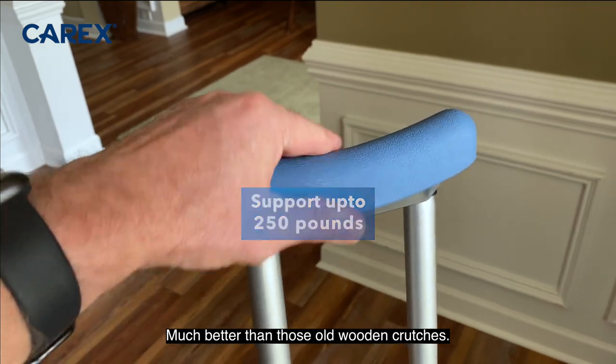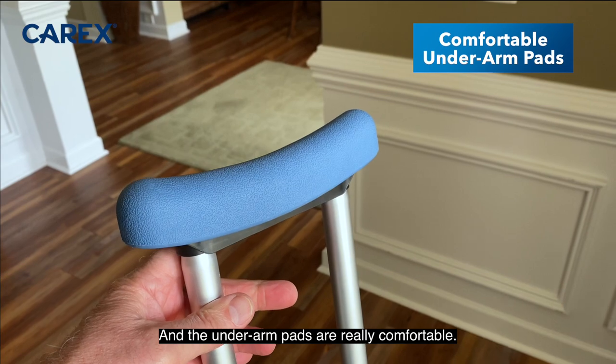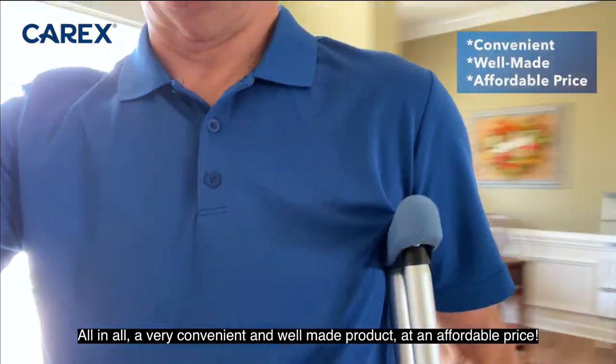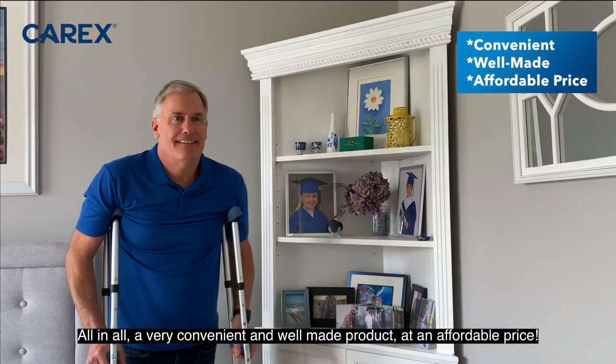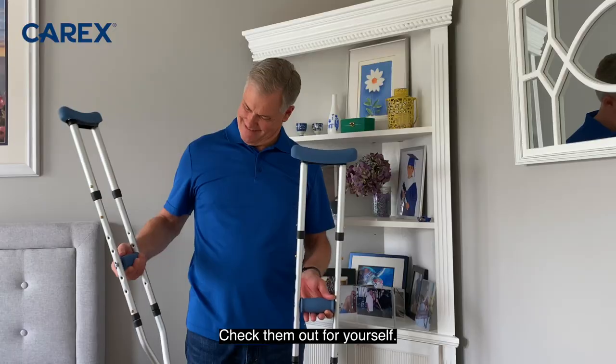Much better than those old wooden crutches. And the underarm pads are really comfortable. All in all, a very convenient, well-made product at an affordable price. I wouldn't expect anything less from Carex. Check them out for yourself.